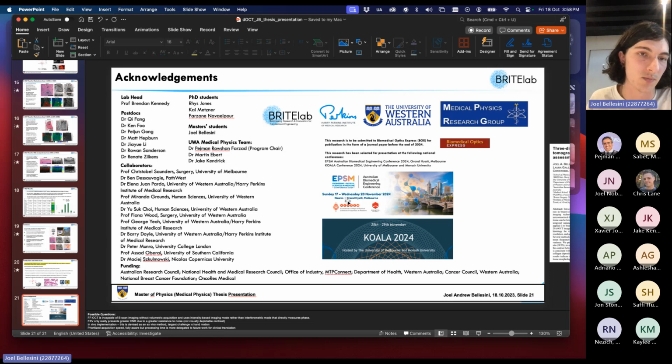I know OCT has also been used in ophthalmology, dermatology, and I think in some aspects of oncology for skin cancer diagnosis as well, due to the really thin penetration depth but high microstructural detail which it can obtain. So yeah, there is future work to be done to inspect how, when things change in size and depth, that affects the diagnostic accuracy. That is something which, like I said, we didn't have the means to thoroughly inspect due to our limited data set. But yeah, it's a good point.